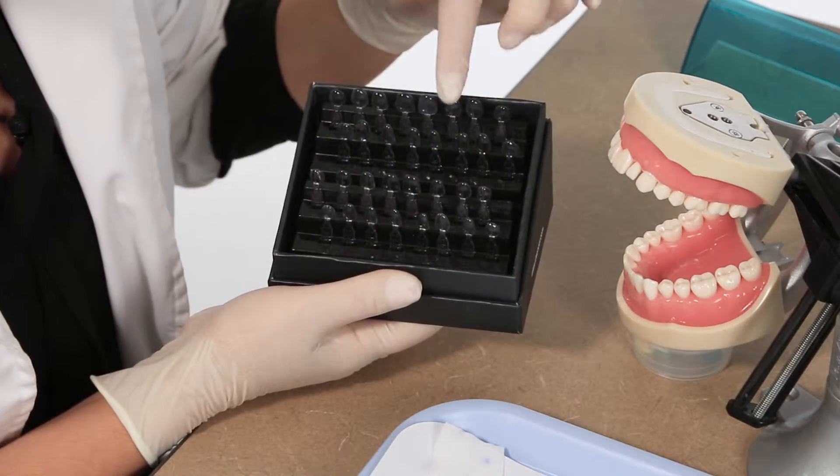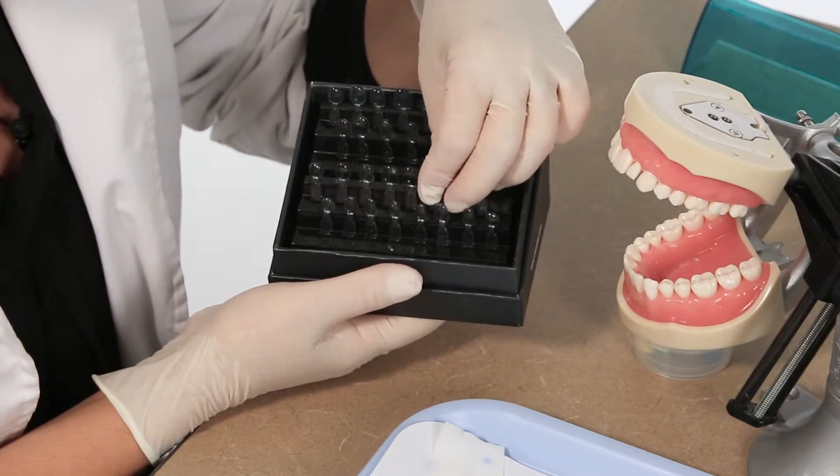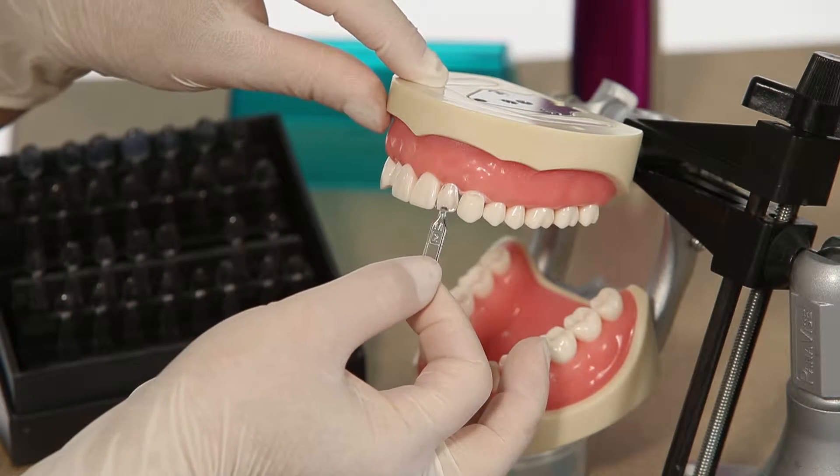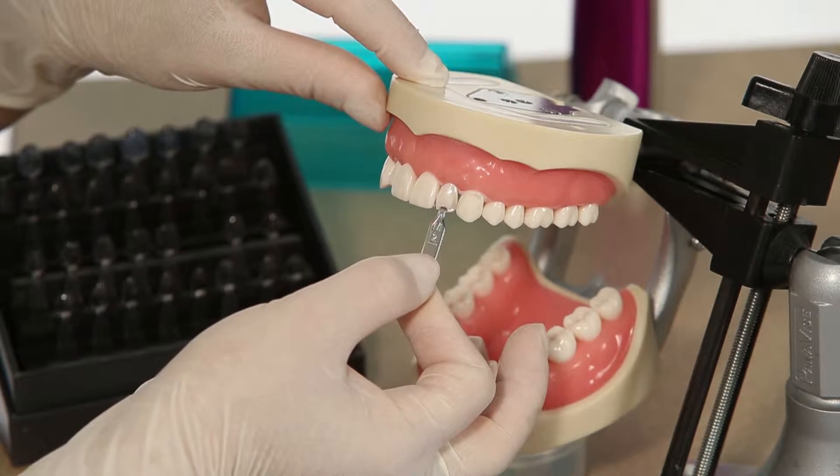Before starting the procedure, select the correct template size. Make sure the template covers the tooth from mesial to distal and up to the gum line.